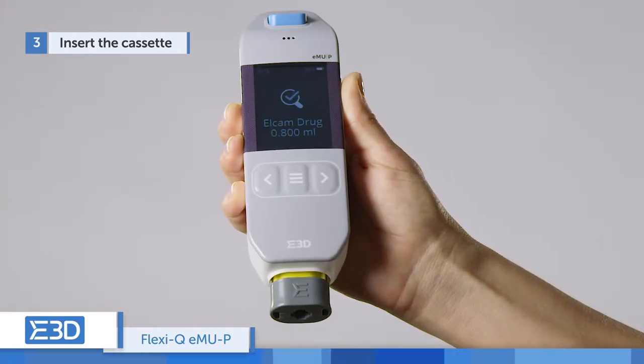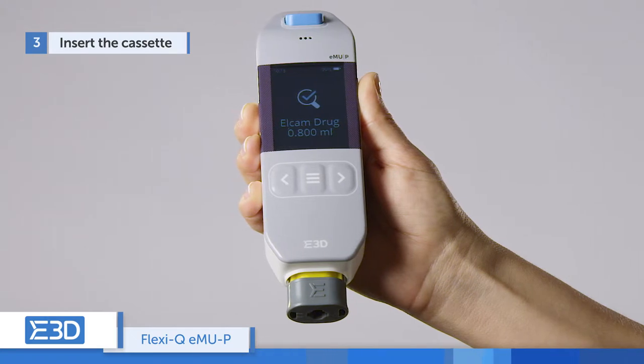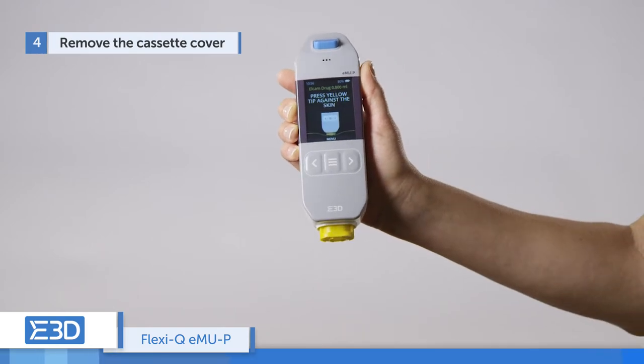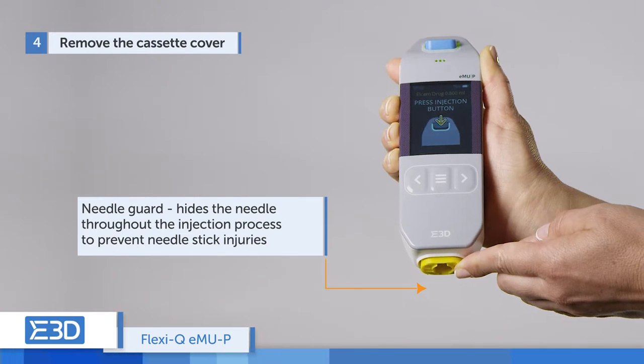The device reads the cassette information, identifies the type of drug to be administered, and verifies the expiration date. Remove the cassette cover.